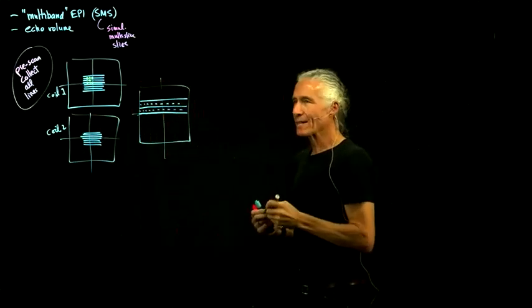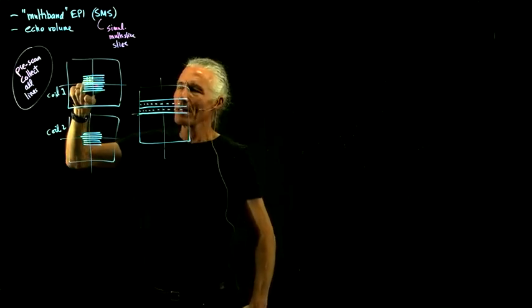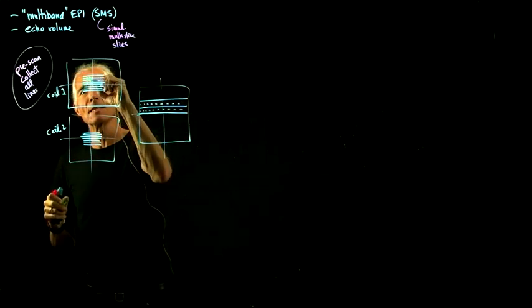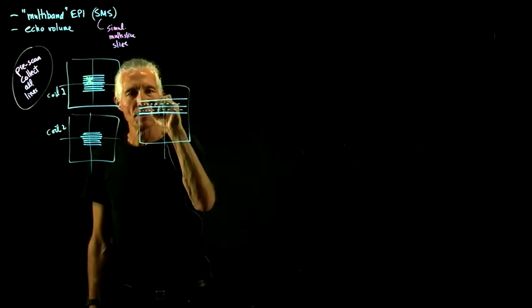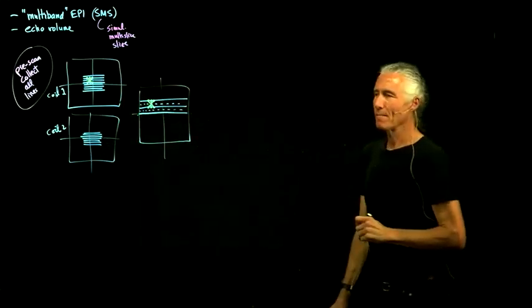So we actually have the data here, and so we can train a little predictor to say, given these points, predict what the actual data that we recorded was at that point. And once we have that little machine, because we actually know what it was, because we collected it, do the same thing over here. So here, now you've got 3 data points over 6 data points over here, and we can use them to predict what that data point is.